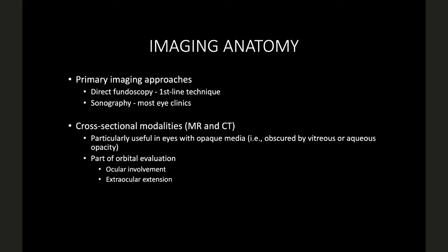Having said that you need the modalities, when do we need an MR and when do we need a CT? We've been having these series of radiology talks. So what is the rule of thumb? When does one get a CT? What does it really show better than MR? And when do we get an MR which shows better than CT? Can someone say that? Or do you guys believe that always MR is better or always CT is better?